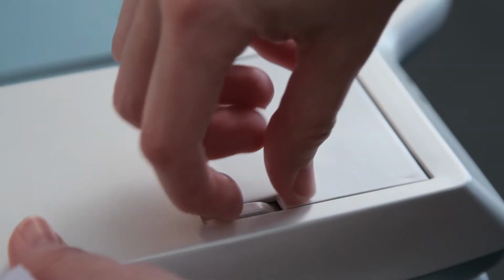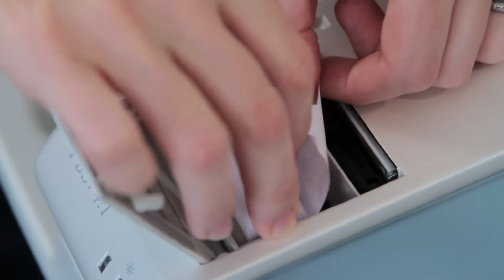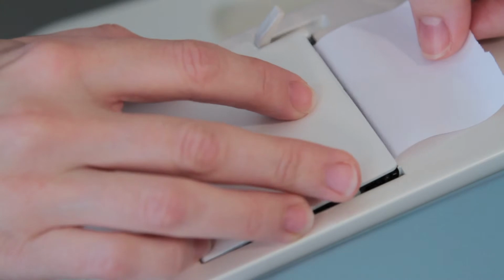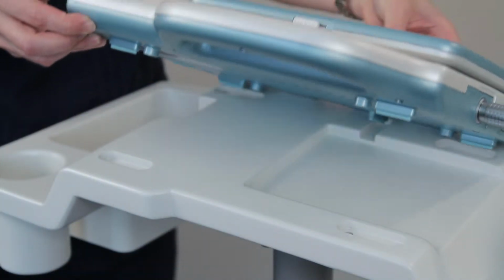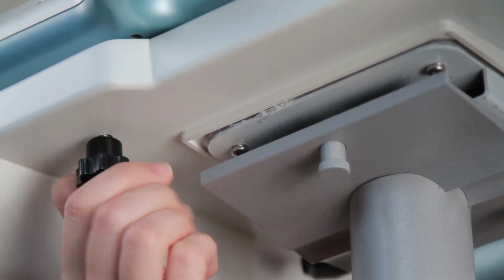To add paper to the onboard printer, open the printer door by lifting the latch. Put the paper into the paper box with the roll facing the top of the device. Pull out the paper so that it is exposed when you close the door. Next, secure the device tightly to the accessory tray attached to the rolling cart.